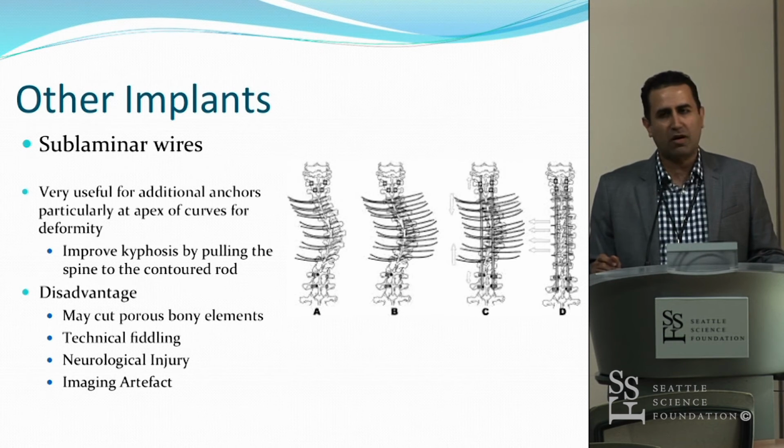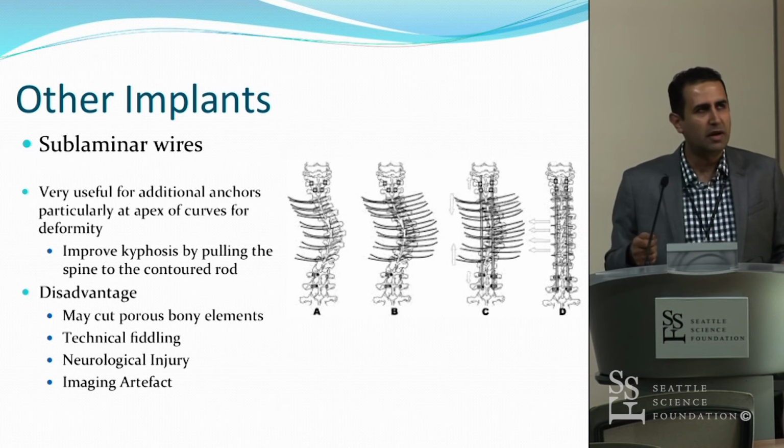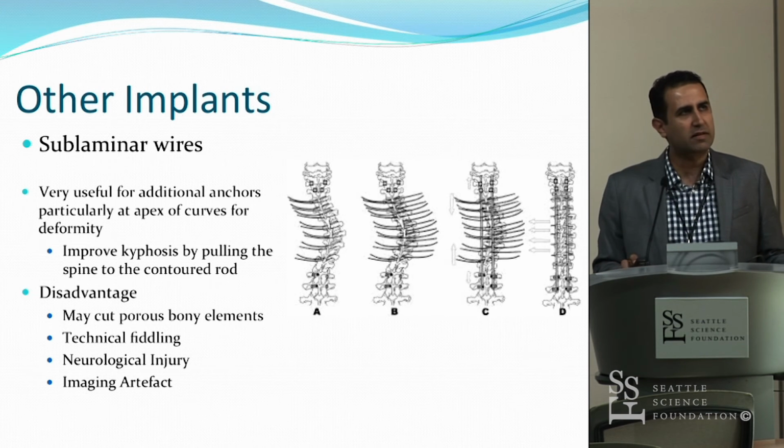The problem is obviously it can cut through the porous elements of the bone. It's a fiddle because you have to feed it under and feed it over, particularly in the craniocervical region. It can lead to neurological injury and imaging artifact.